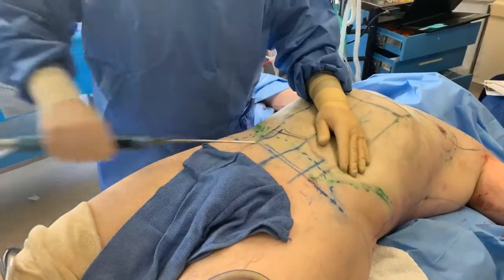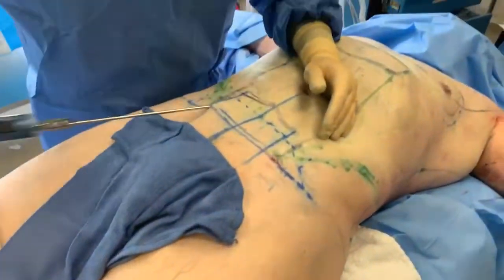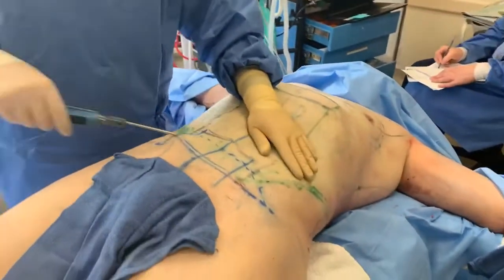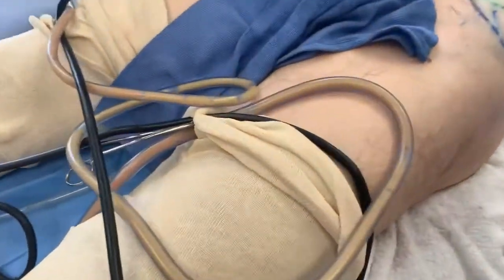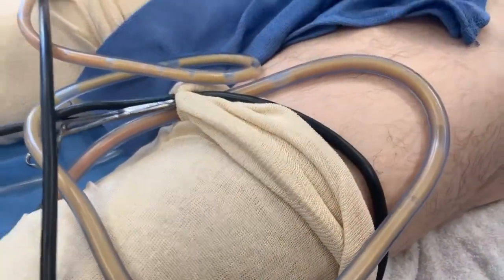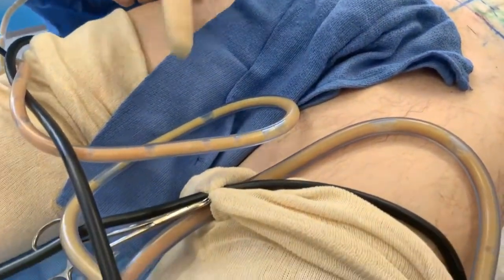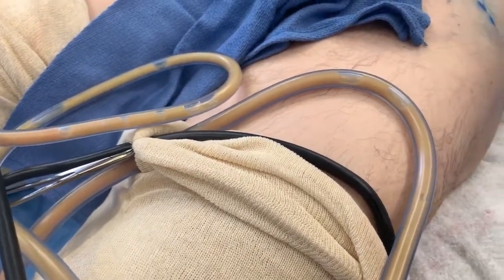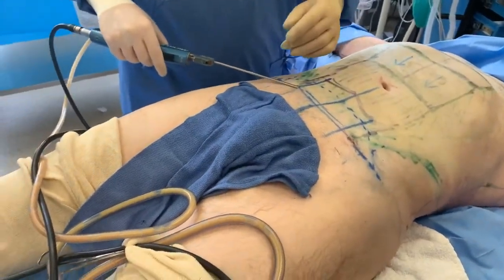You can see there's a lot in there and it's coming out fast. The great thing is there's no blood, oil, or debris. It's really, really clean and we're going to be filtering it as well through pure graft filters. Take a look at the fat — that's exactly how it should look. It should be really yellow with very little blood. You can see with men there's some connective tissue in there, but overall it's very pure and that's going to be great once it goes through the filtration process.